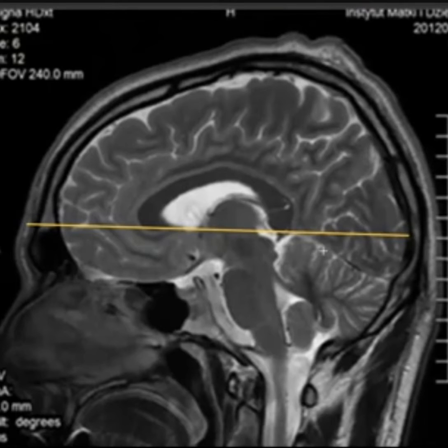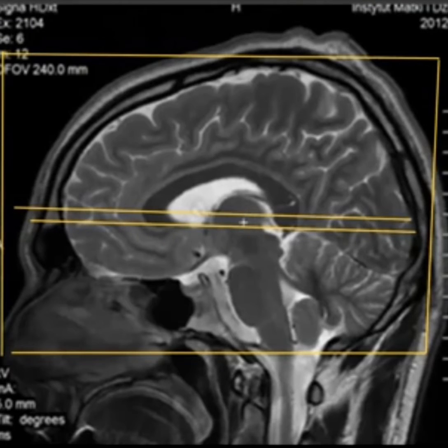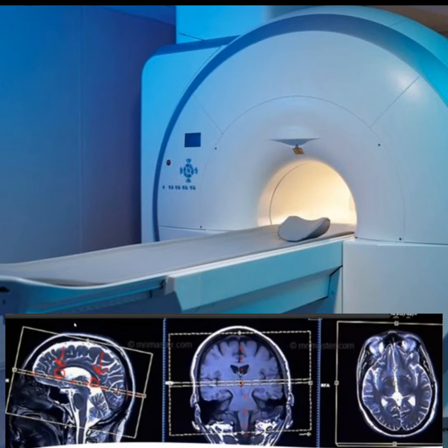So slice coverage in this case is from the foramen magnum, the opening in our skull, to the vertex, which is the very top of our skull. This is a 3-plane view of what we just did, and we know that we did axial because on an axial image we see the boxes, there's no line across that.